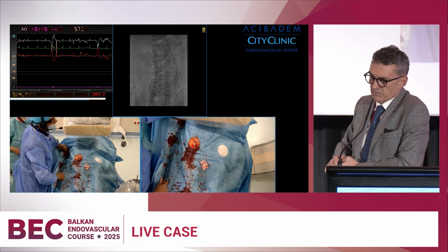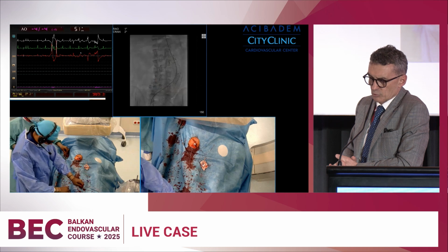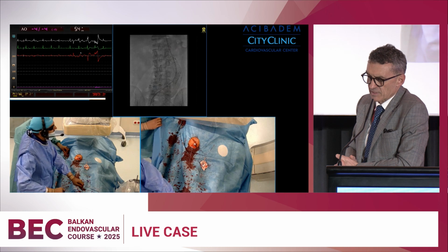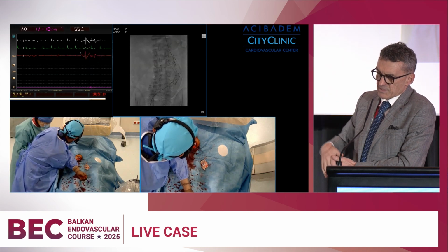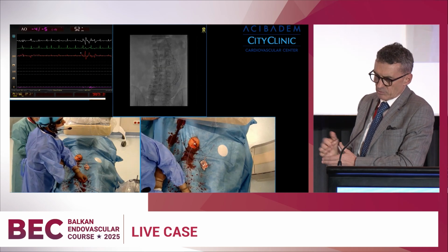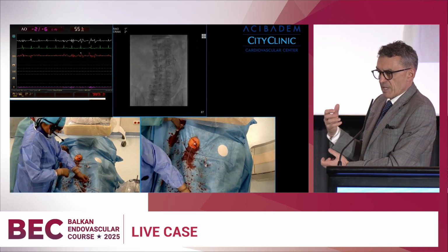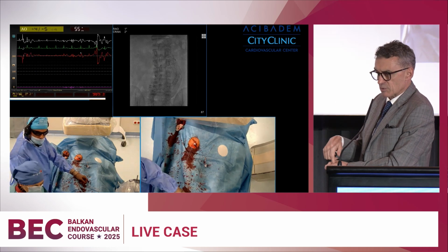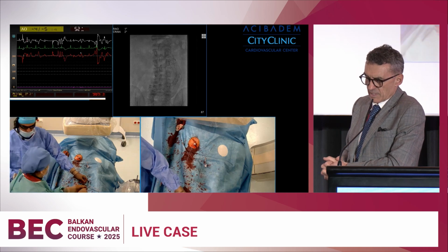He will put a catheter, in this case the catheter from the lasso, but it's possible to introduce any of the catheters, and after having access into the aortic arch, he will escalate the Lunderquist wire that is the stiffest one possible, with a very good flexible tip. But the main body of the Lunderquist is very supportive, and on the Lunderquist he will implant the additional Endurant endograft.